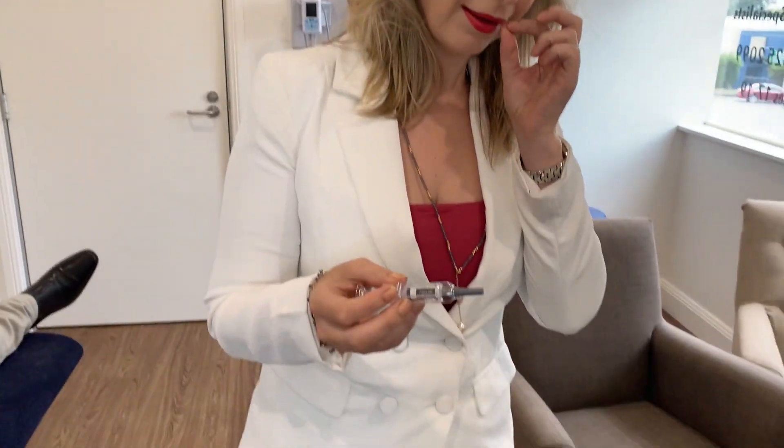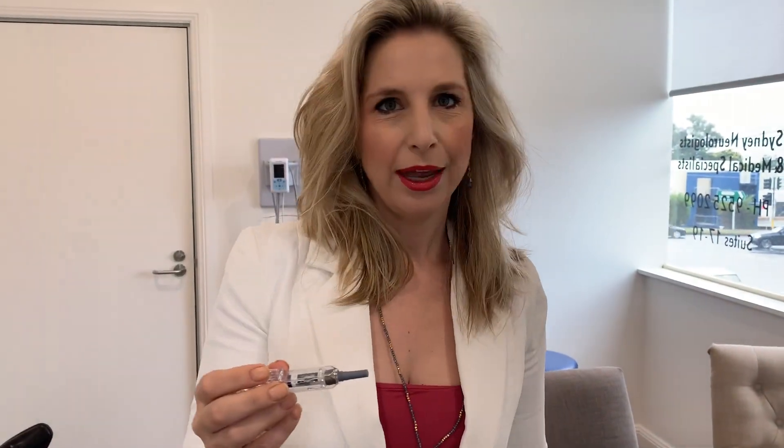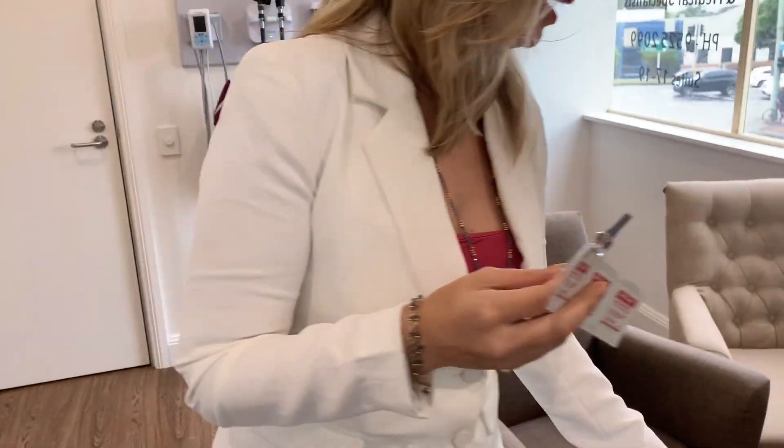When you get your Simponi, it comes in a little box like this. It will have your name on it — the name has been crossed out for patient confidentiality. You get out the Simponi and it looks like this, and you get alcohol swabs, and then you'll need a band-aid as well.